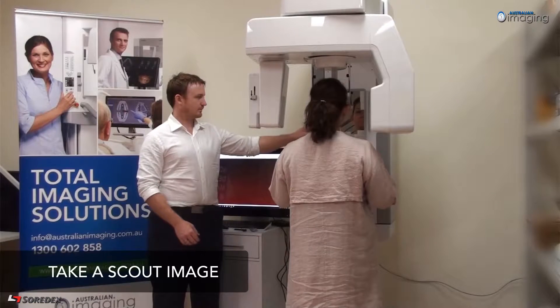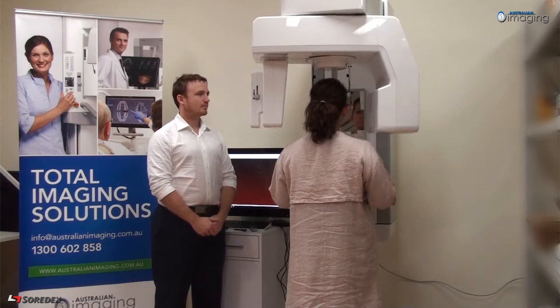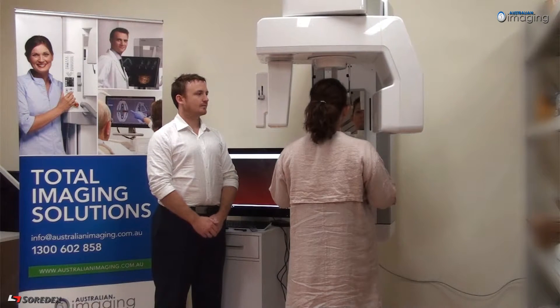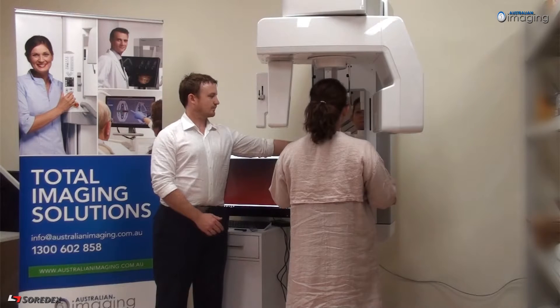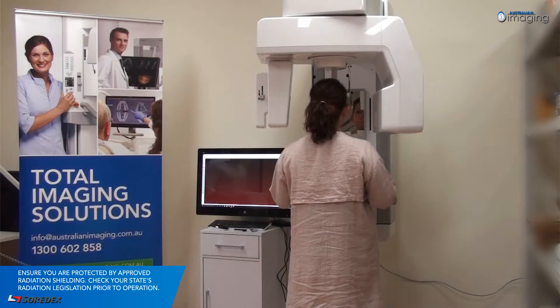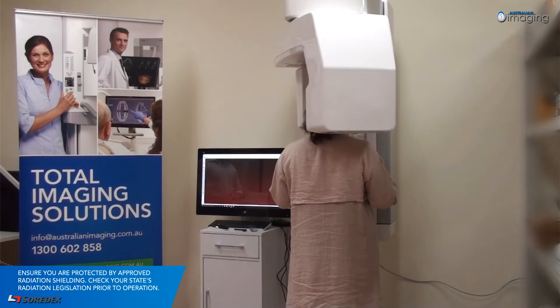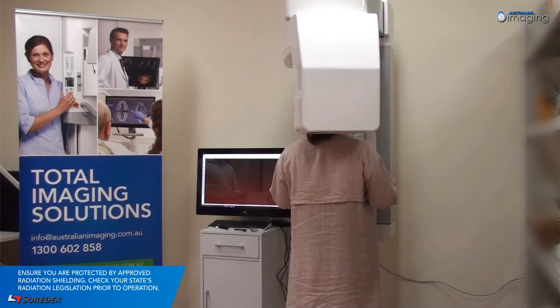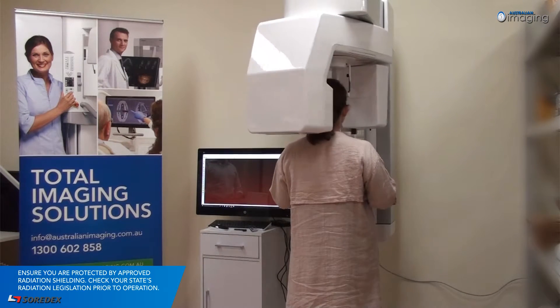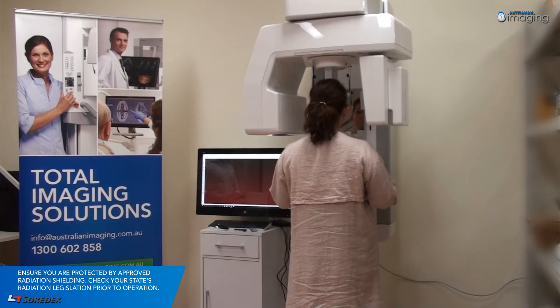To ensure your image is set up correctly, we recommend taking a low-dose scout. Begin by pressing the return button. On the control panel, select the scout modality, protect yourself from radiation, and then press and hold down on the exposure button. The scout image will appear in the control panel where you can make any necessary positioning adjustments. Height adjustments require manual correction of the chin rest, whilst all other adjustments can be performed using the arrow keys on the unit screen. Retake the scout if major adjustments were made.